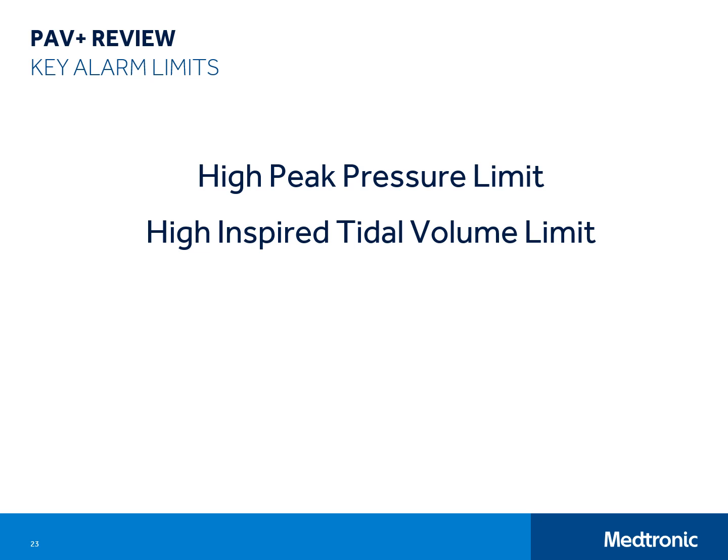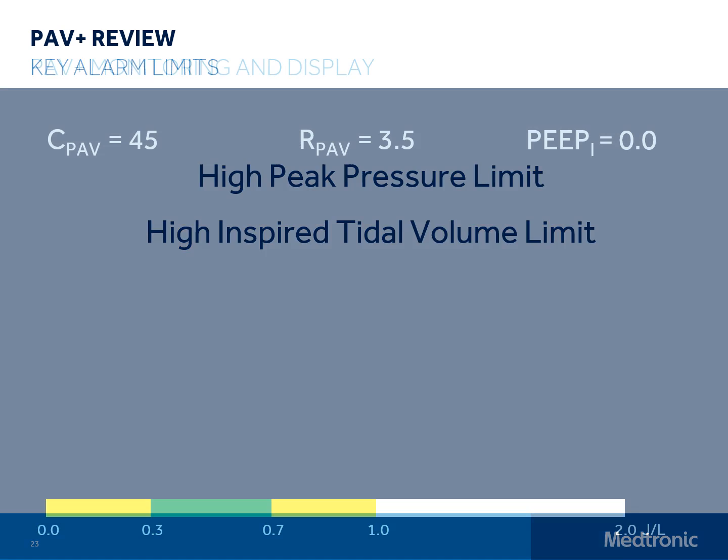These parameters should be set with the patient's safety as well as patient comfort in mind. Too low a setting on either of these parameters may truncate breaths frequently, leading to patient discomfort and nuisance alarms. Too high a setting could allow excessive pressures or tidal volumes to be delivered. Good clinical judgment should be used to set these alarms.